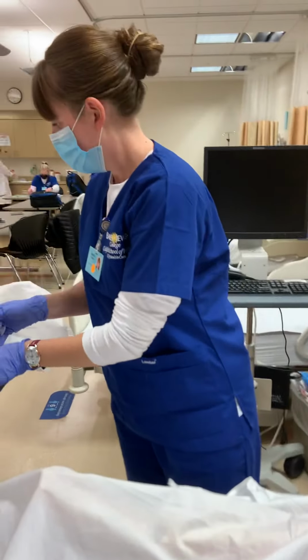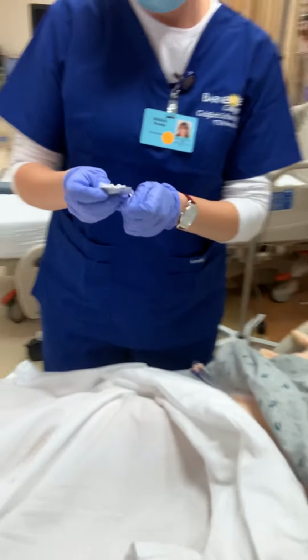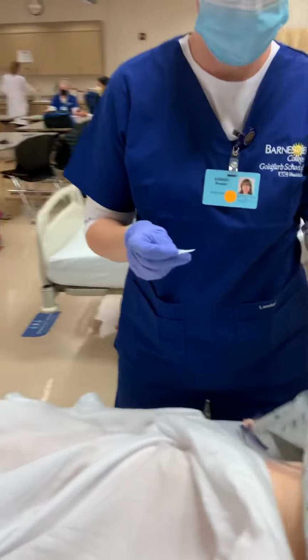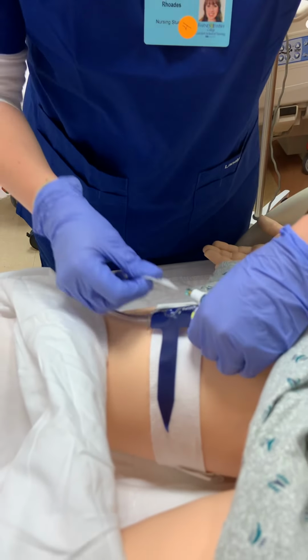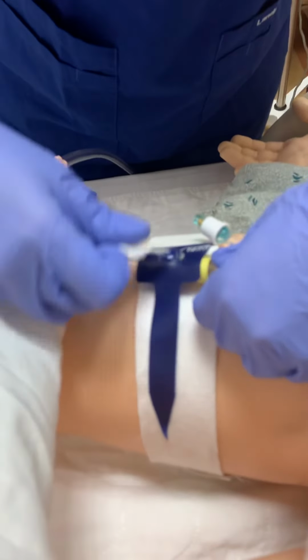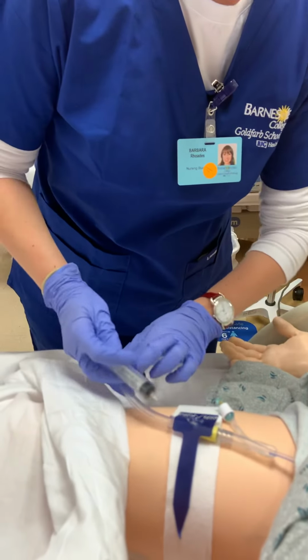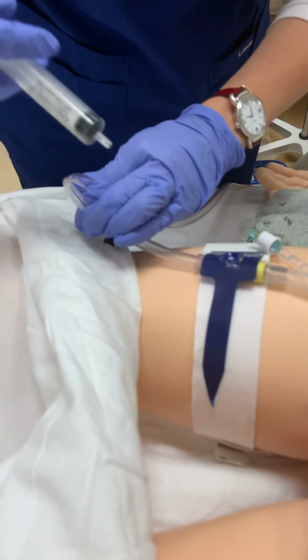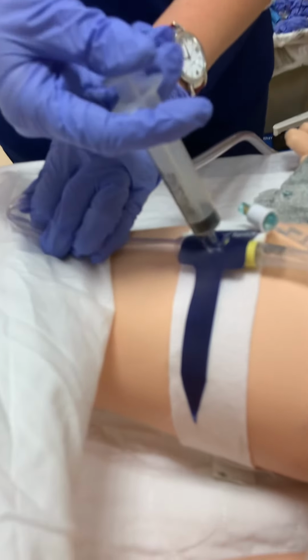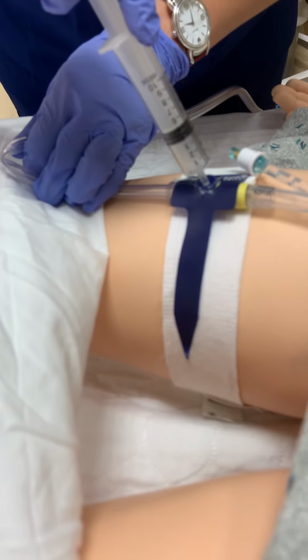So, alcohol swab. In the area here, I'm just going to lift up your gown just a little bit. Okay, make sure I clean this area really well. Okay. And I'm going to cinch it here so that the new urine stays here rather than going down into the bag. Okay, I'm going to draw up a sample.